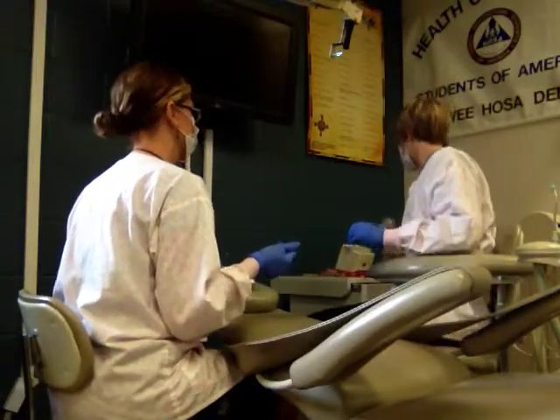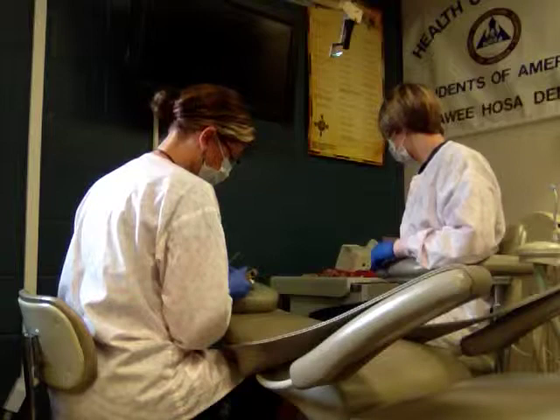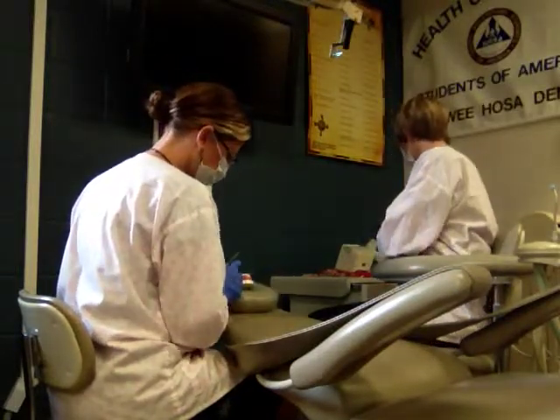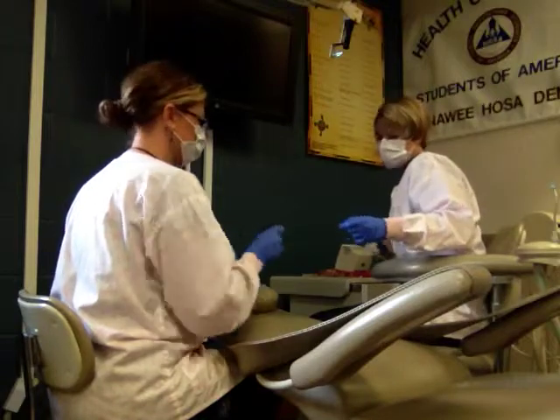Then we'll use regular composite, and I will need the plastic instrument. This is where two-handed passing can come into play. We'll shape the composite where needed, fold that mylar strip over the tooth, and then go ahead and hit it with the curing light.